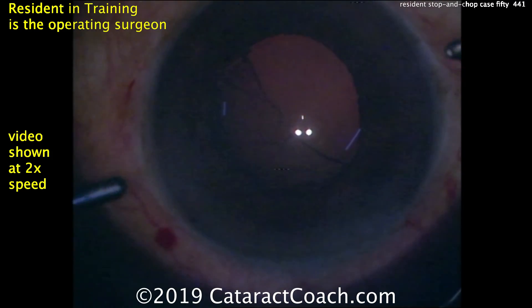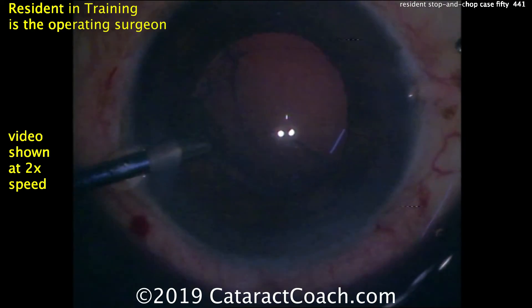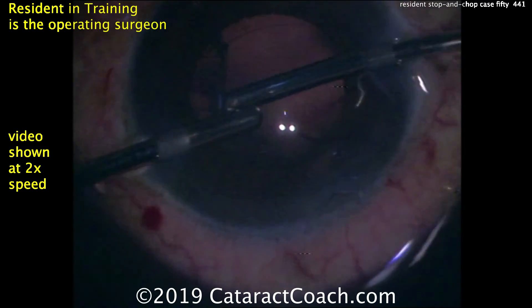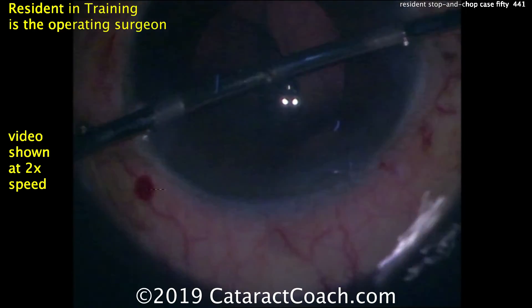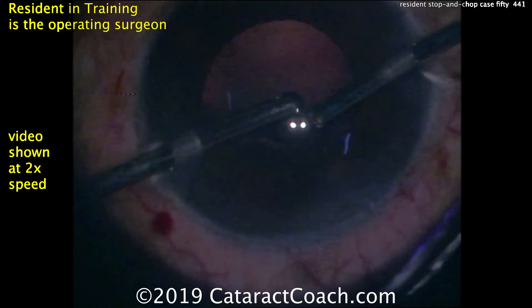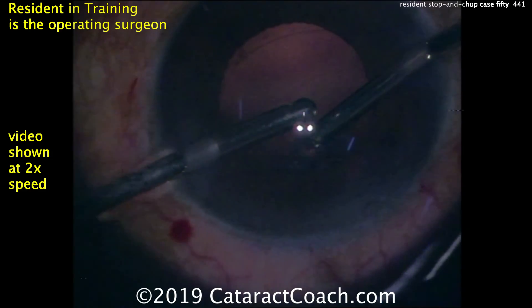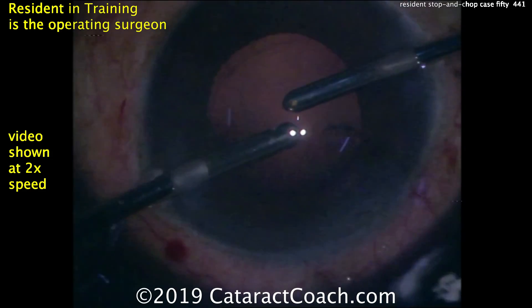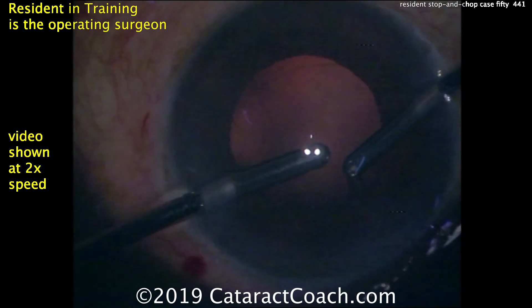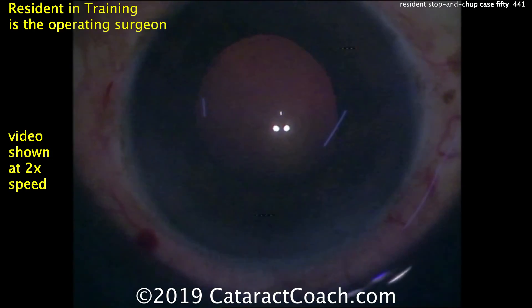Looks like it's probably a 23-gauge bimanual irrigation aspiration setup. The surgeon switches hands — infusion in the left, aspirator in the right — to remove the remaining lens cortex material. The sub-incisional stuff is being removed and this looks pretty clean. Good job also in keeping the eye in primary throughout the surgery — the eye hasn't drifted away, staying central the whole time.